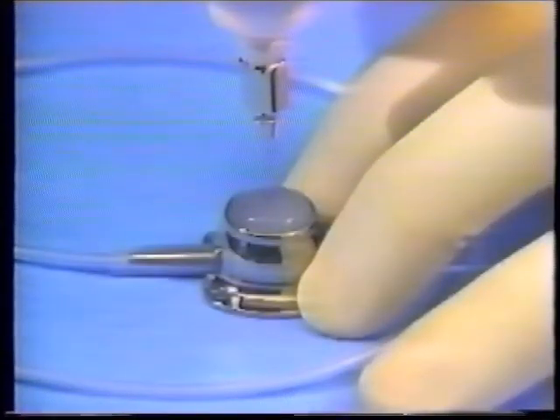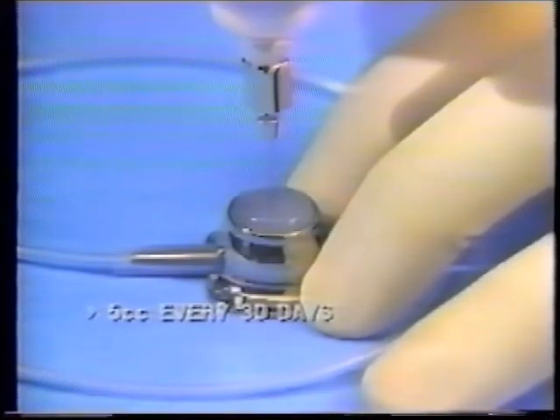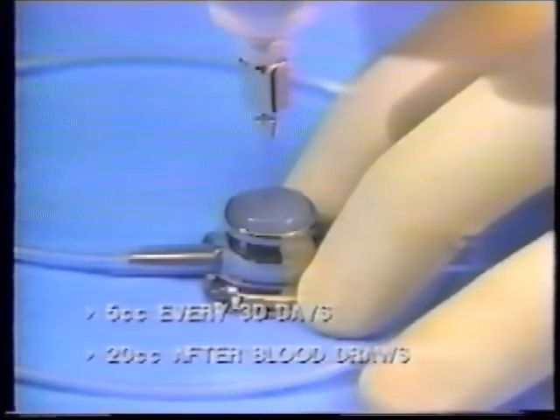The routine flushing protocol for the Groshong port system is 5 cc's every 30 days when the port is not in use or after consecutive medication doses. 20 cc's after blood draws, medication, or TPN infusion.